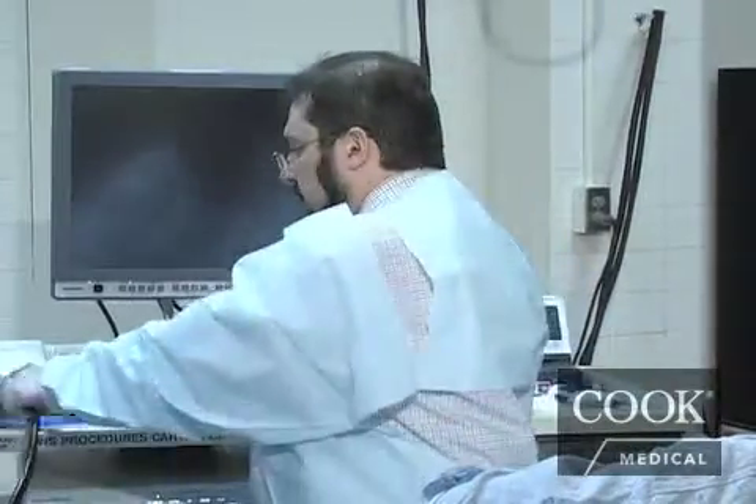Typically, we insert the echo endoscope to the level of the celiac artery. The echo endoscope is inserted in the patient's esophagus — it was a smooth intubation. When we are at about 35 centimeters from the incisors, we switch to ultrasound.